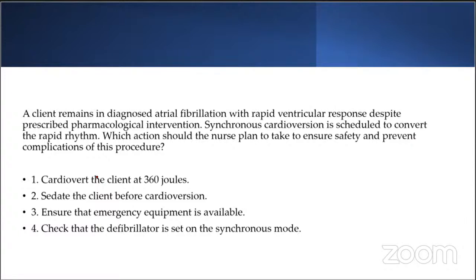Yesterday, we talked about synchronized cardioversion, and we attempted to differentiate it from defibrillation, because both of them, like we said yesterday, are electrical therapies. These are electrical therapies you can use to treat your patients. So again, they're asking us what action the nurse should plan to take to ensure safety and prevent complications.